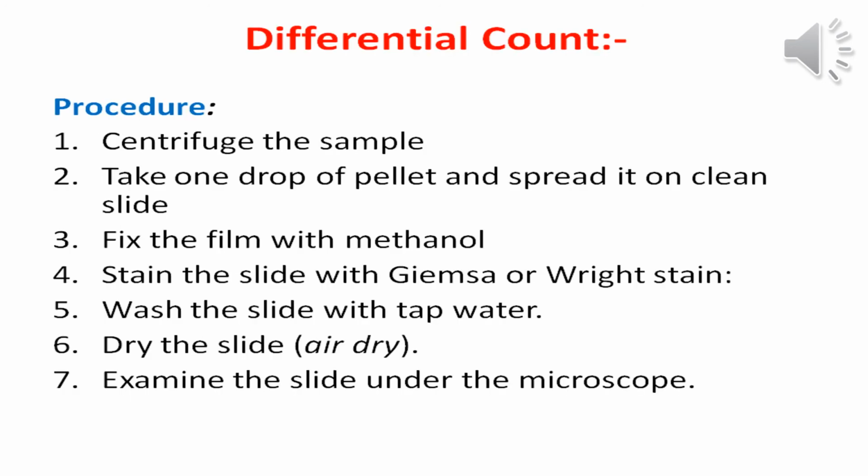Here I will talk about differential count. Differential count is very important to detect the type of infection. If the meningitis is due to bacterial infection or viral infection, it's very important to know the type of infection.